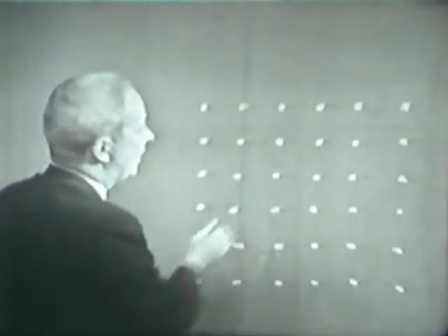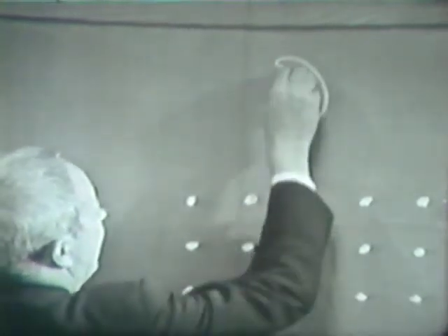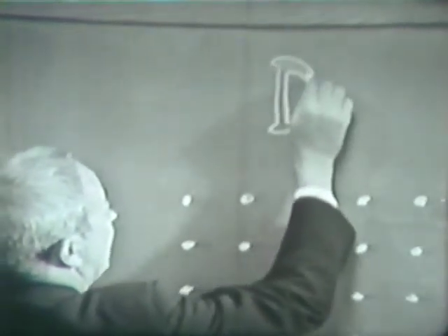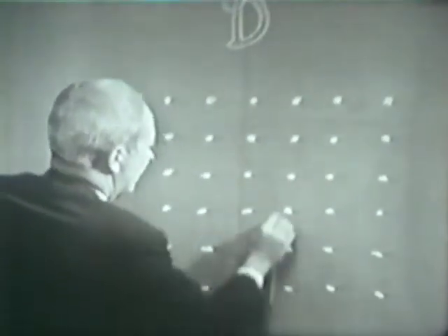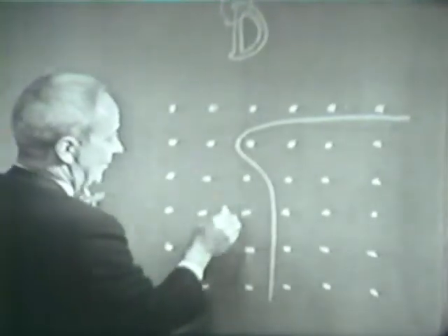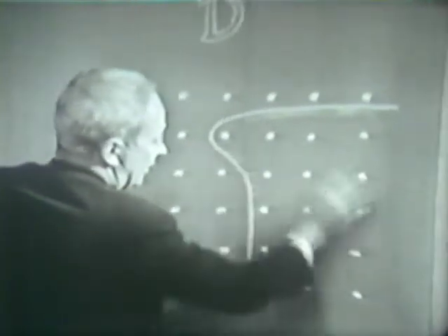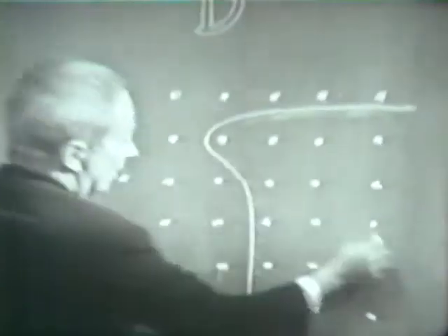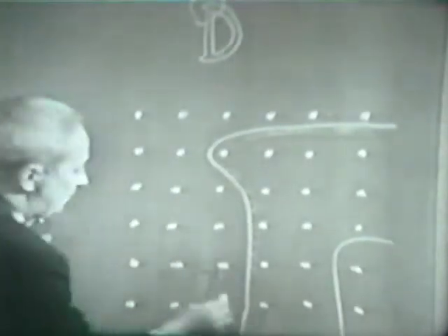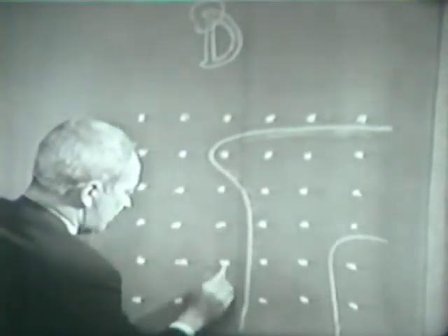Well, I'll take an example. If the scanner happened to have a capital D on it, then the black region would be in there. And if I want to blow up the upper left-hand corner here, I could say that maybe the D is coming in like this. So it really is expanded. It really should be expanded even more. So in here is black. That's all black area over here. There's the inside corner here, but we don't have to worry about that. And now, let's say that the scanner gets going. I want to start it up here, I think.